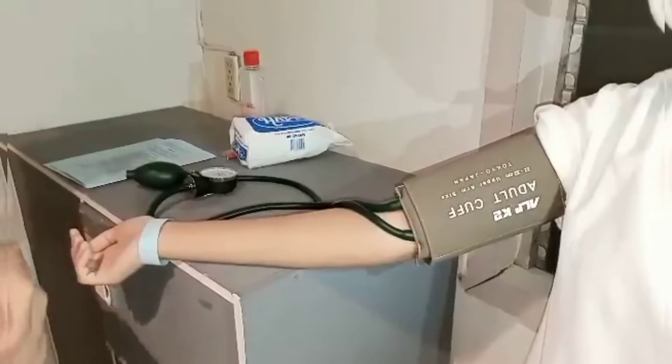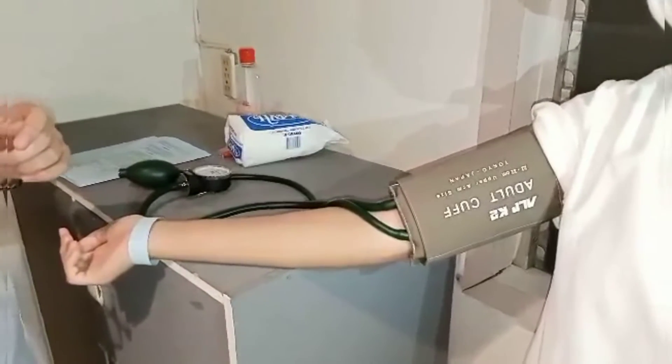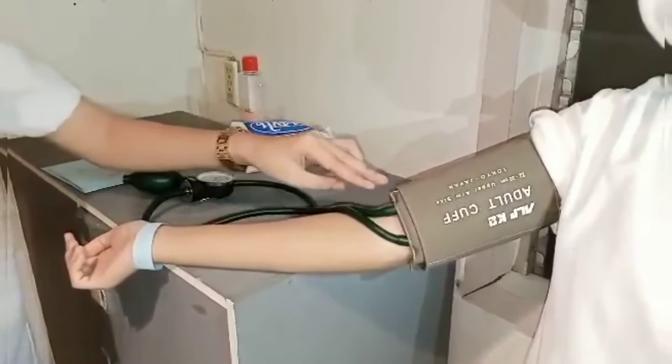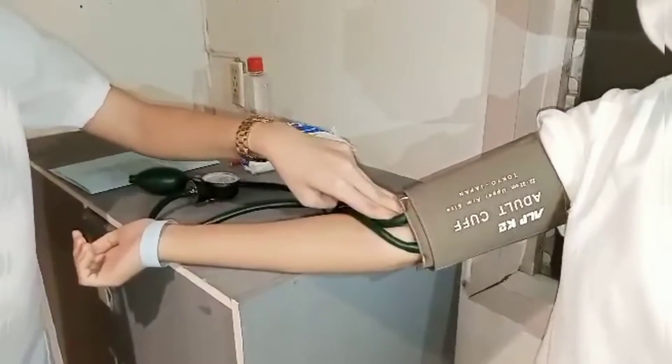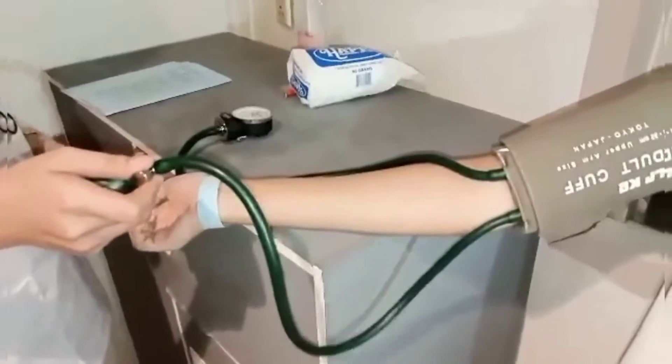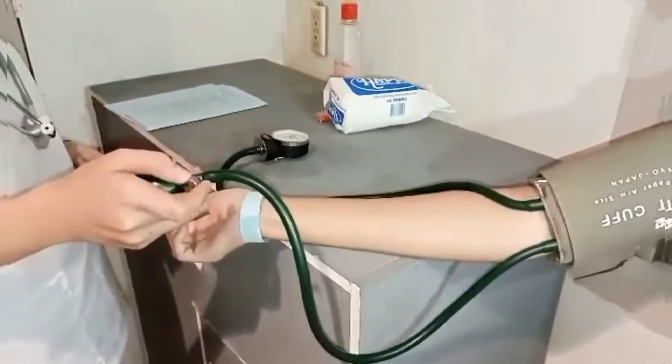I'm going to palpate the brachial artery or radial pulse by pressing gently with my fingertips. Next, tighten the screw valve on the air pump and inflate the cuff while continuing to palpate the artery.